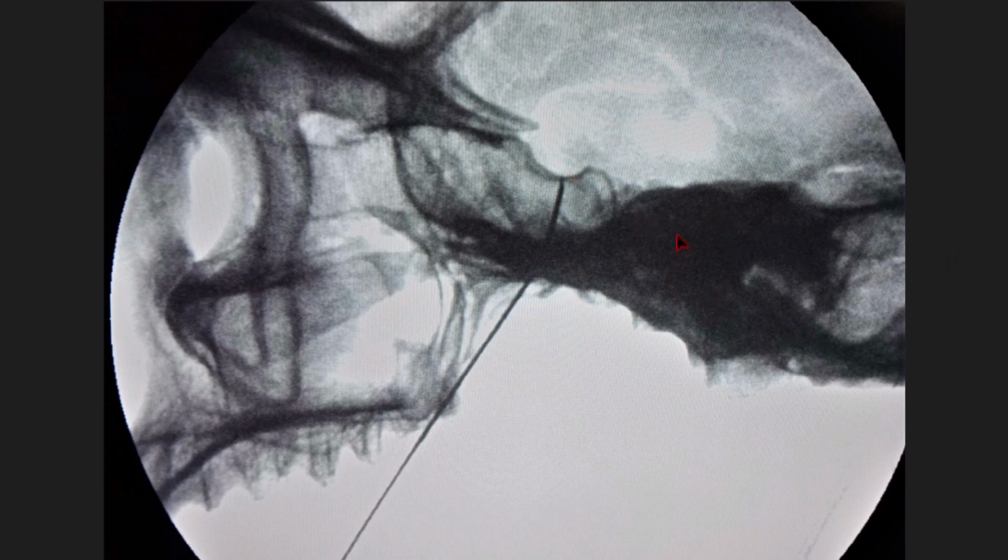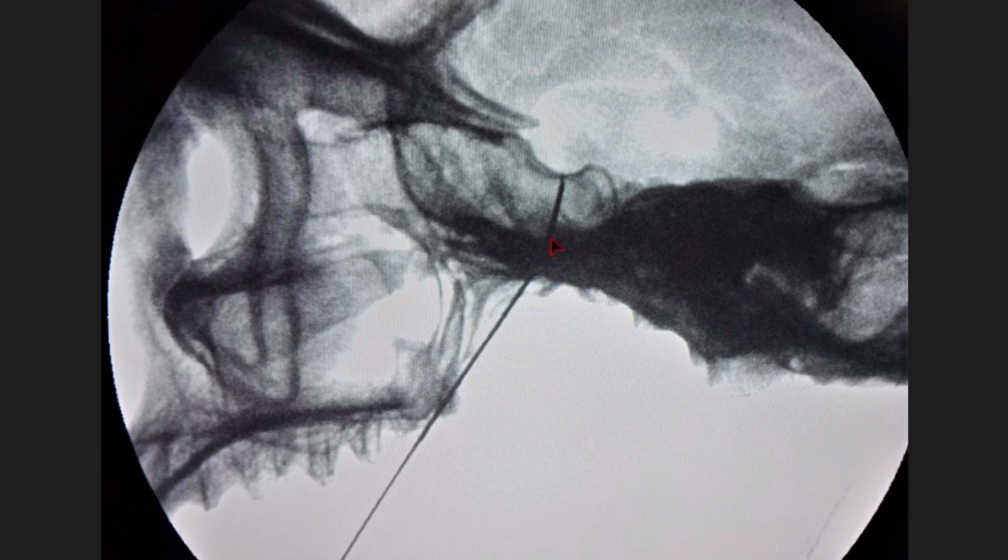So it is very, very important to see the lateral view. If we're thinking of V1, V2, in submental oblique view, you have to take the needle more medially, and then in lateral view, you take the needle quite up, almost up to the base of the sella turcica, because there you will get the V1 and at this level you get the V2. But you can see the trajectory is not coming towards the clivus petrous junction. Okay, so that's a very important thing.